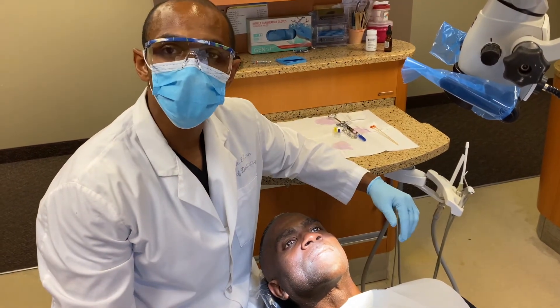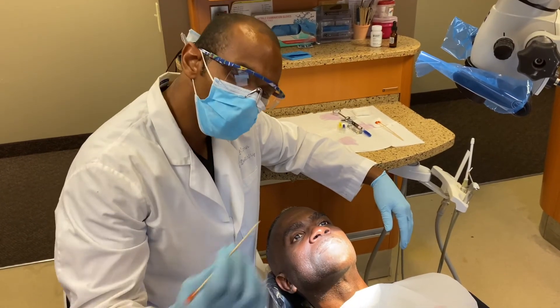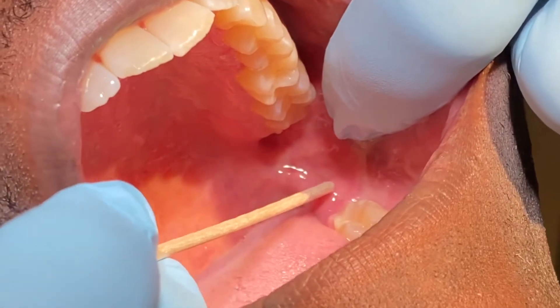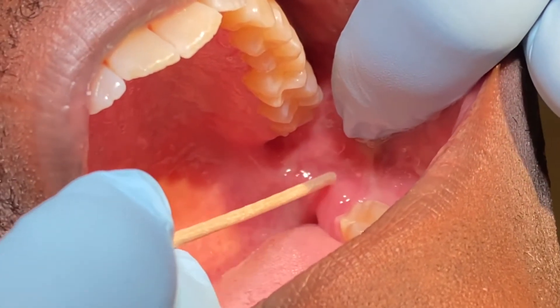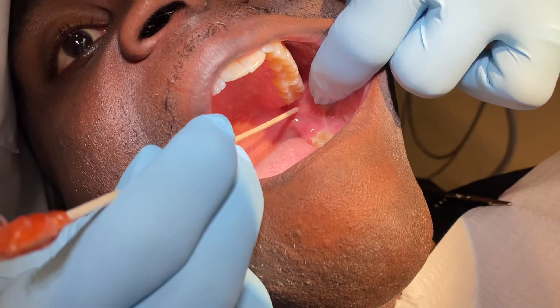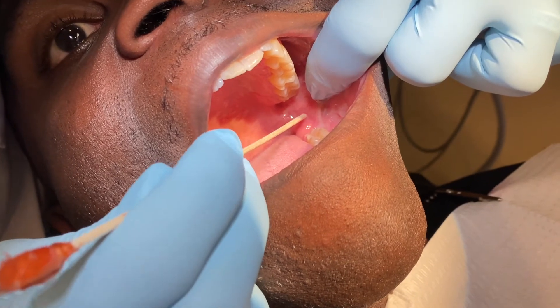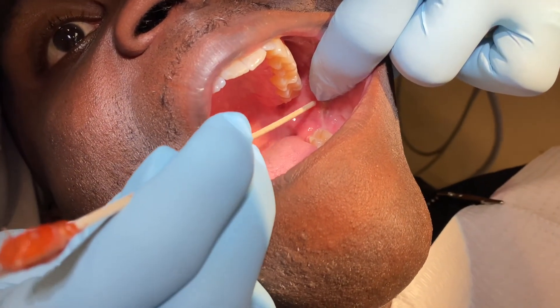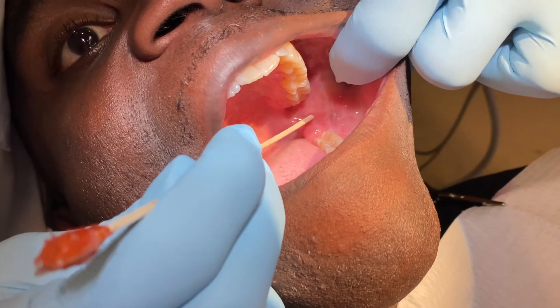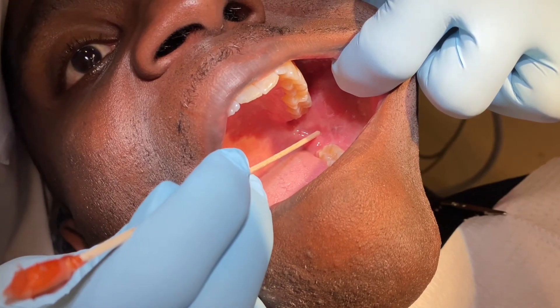There are some landmarks we want to talk about. I'm going to use the back of this cotton tip applicator to point out some landmarks. What we're looking at is a retromolar triangle. You can see this area here — this forms what we call the retromolar triangle. We are looking at the anterior border of the ramus, which is obviously under the soft tissue, and I like to use the exterior oblique ridge of the ramus as well, and the pterygomandibular ligament. All of these landmarks form this triangle.